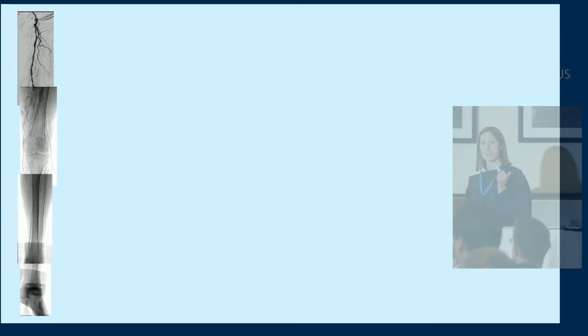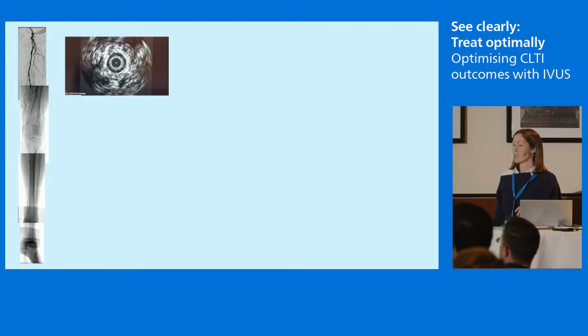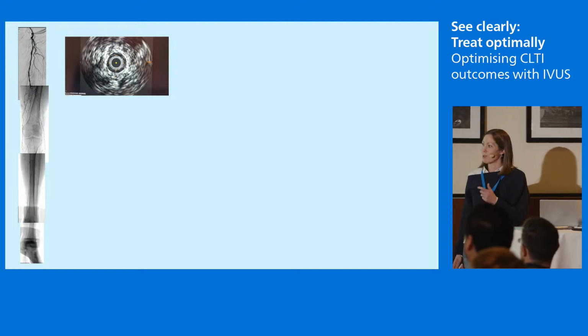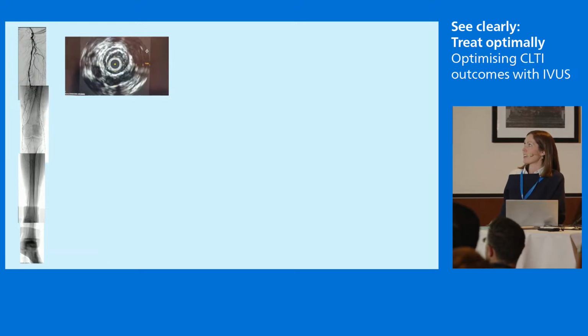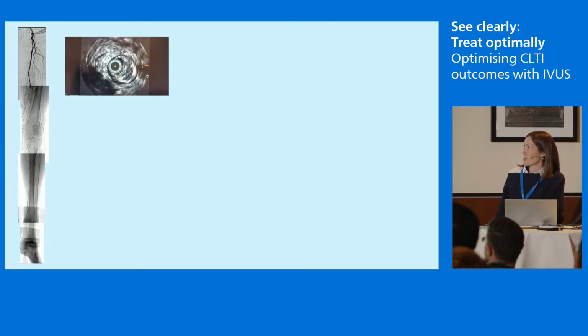But my plan was to try and cross luminal and then to leave nothing behind. So luminal, potentially vessel prep, and DCB. That was my plan. So I come to the crossing. Now, the crossing was not as easy as I'd anticipated or hoped. I went through my range of delicate little 014 CTO wires to try and get across, but I struggled. This was the crossing IVUS, and I'll let these play through quickly because I think everyone's seen quite a lot, but you'll see here that I'm subintimal in a couple of areas where I had hoped not to be subintimal.